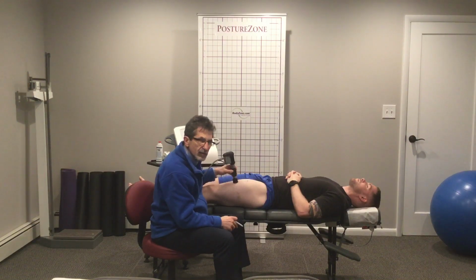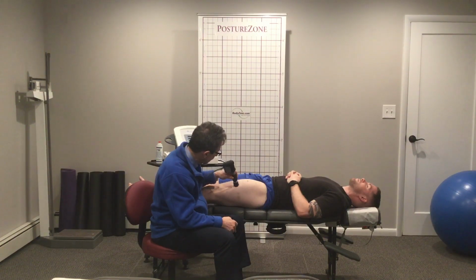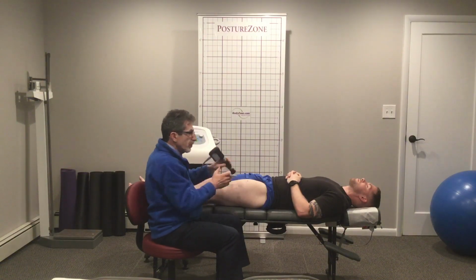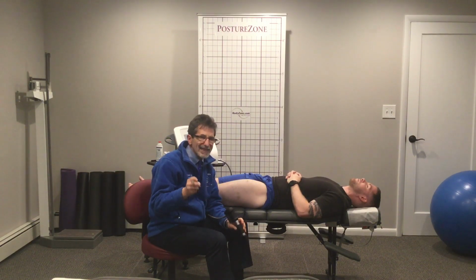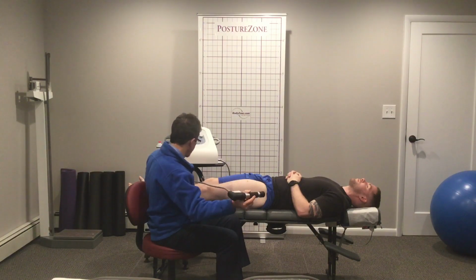I wouldn't do this the same day, but I would do it on day 3 for sure after a muscle pull. You could do it on day 2, all right? Day 1, you want to give that a chance to calm down. Remember, your inflammatory cascade with muscles and soft tissues lasts about 3 days, the initial insult. Then you want to stop that inflammatory cascade and prevent that secondary zone of injury from occurring from prolonged inflammation.